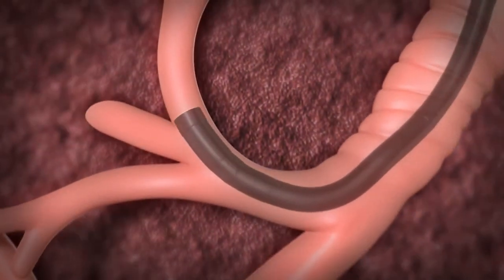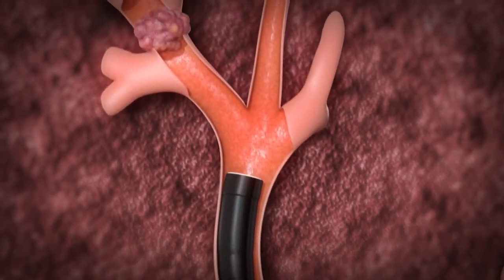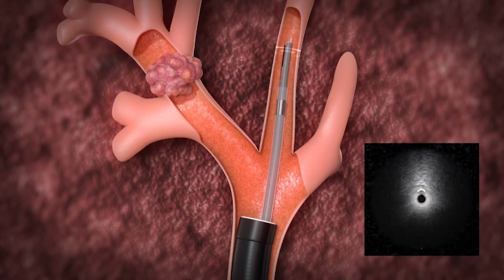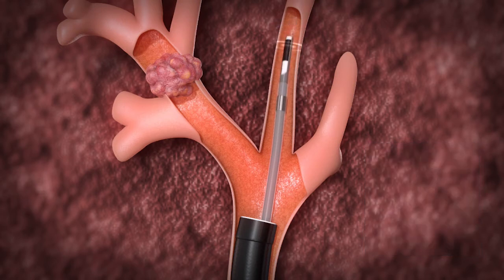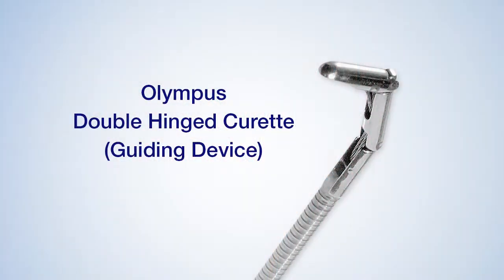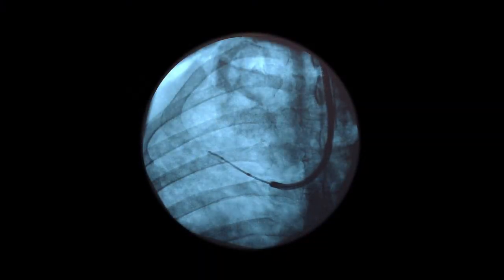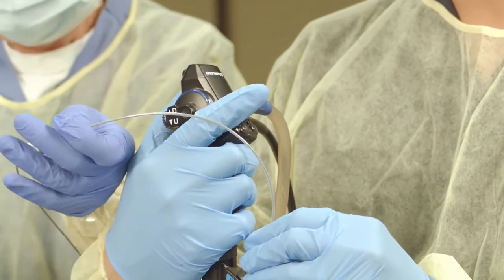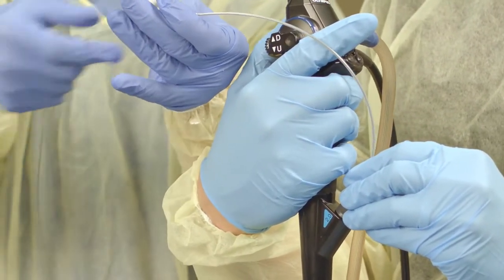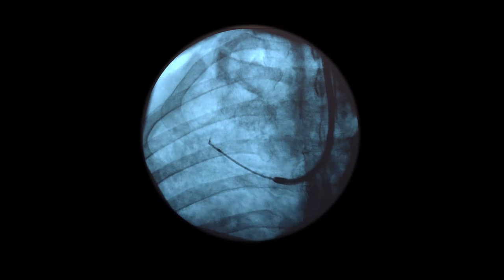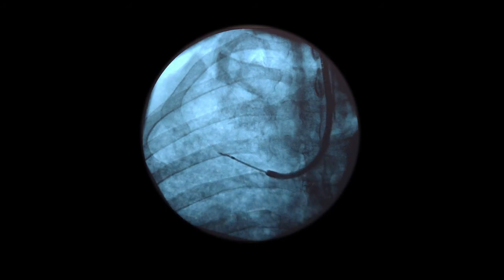In some cases, despite careful planning, the peripheral lesion may not be identified with initial inspection using the radial ultrasound probe. The guide sheath is not a steerable device, and redirecting it may be facilitated by manipulation of the bronchoscope or by using a double-hinged curette. The curette may be flexed or extended and can be rotated 360 degrees when passed through the guide sheath. To reposition the guide sheath, the radial probe is withdrawn and the curette is inserted through the guide sheath under fluoroscopic guidance so that the tip is passed distal to the metal band. Under fluoroscopic guidance, an assistant withdraws the curette and guide sheath proximally, and the curette is flexed or extended and rotated to the desired position.